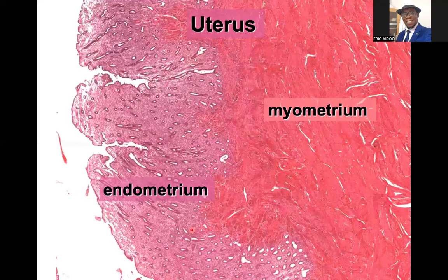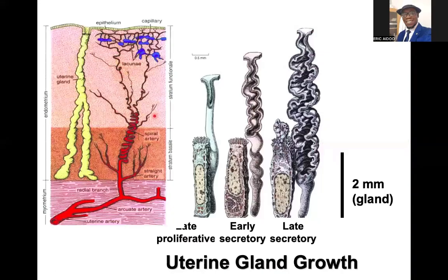So this is a very nice section of the uterus. That will be the lumen, and this will be the lining epithelium. Then as you move outward, you get to the myometrium. This is the endometrium, with these two parts: the stratum functionalis at the most superficial part, and the stratum basale more inner towards the myometrium, where you have a lot of smooth muscle. All the spaces you find there are actually ducts that lead into glandular regions, so all these are endometrial glands.